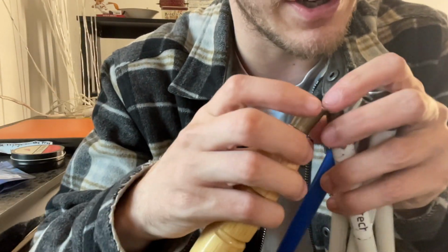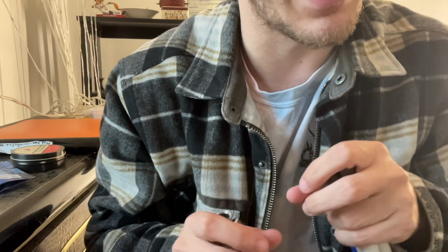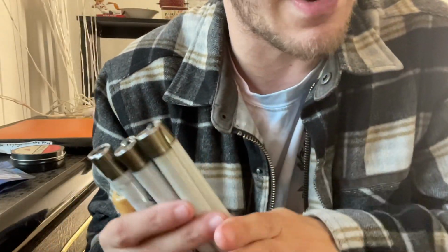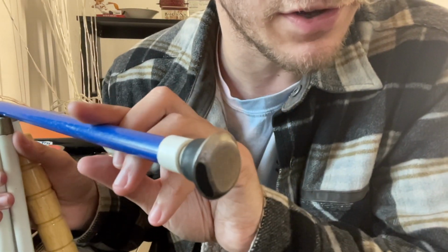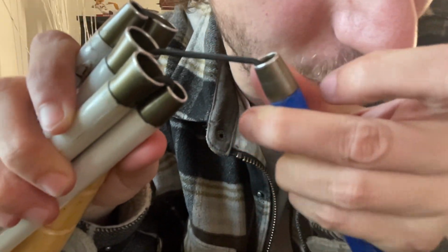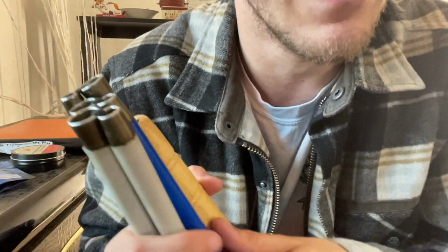Now this cane, because it's been my daily driver, suffers from a unique problem, which is that the bungee cord that is holding, so usually there are two connected pieces that travel from the knot and the top all the way down to the tip of the cane. And this cane, because it has been in use for quite a while, only has one bungee cord of two currently remaining, but it still holds up really well.